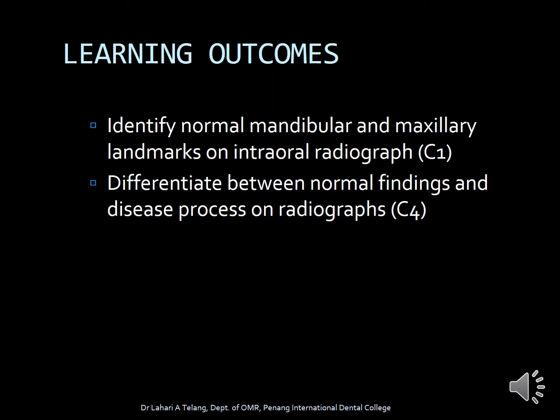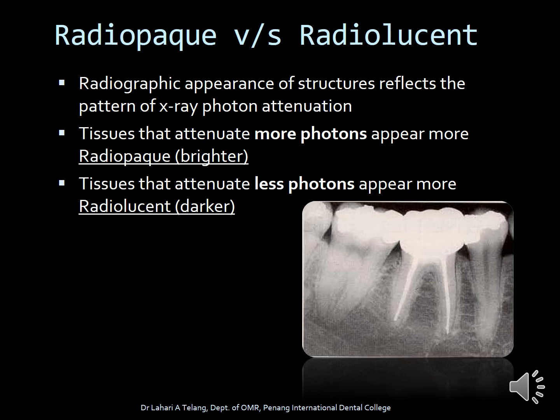We'll be talking about identifying normal mandibular and maxillary landmarks on intraoral radiographs and how to differentiate between normal findings and disease processes. First, it's important to understand the difference between radiopaque and radiolucent. Radiographic appearances of structures reflect the pattern of x-ray photon attenuation. Tissues that attenuate more photons appear more radiopaque or brighter, while tissues that attenuate less photons appear more radiolucent or darker. On this radiograph, the radiolucent aspect is the pulp, and the radiopaque ones are enamel, dentine, and restorations.